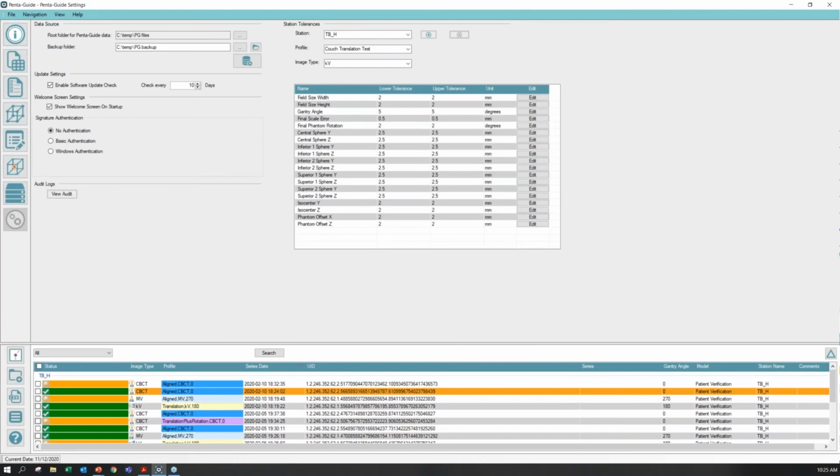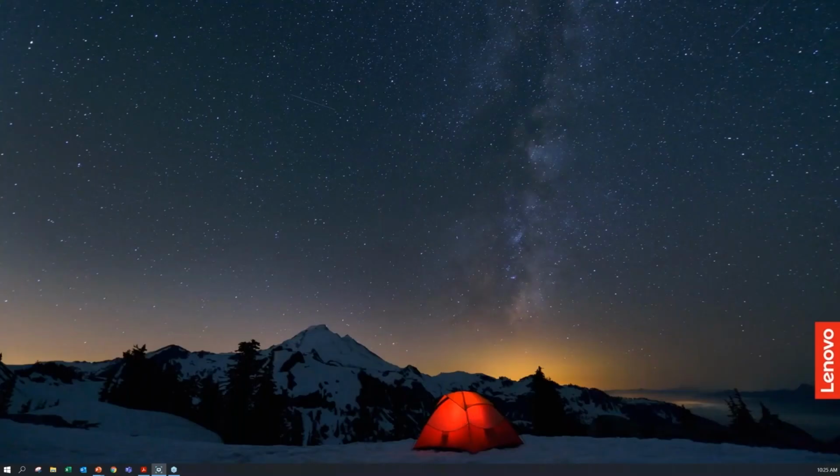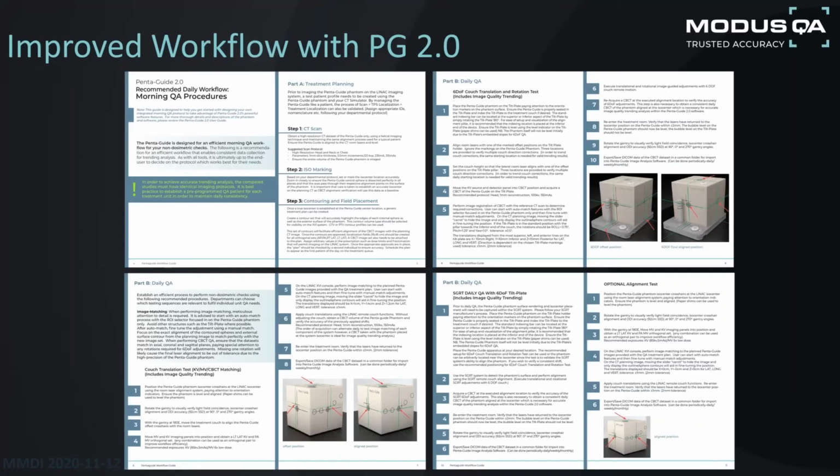Thanks for the demonstration. That seems like a really useful tool, giving physicists helpful information about their systems. And I guess the added checklist and isocenter entry pages should make record keeping easier for those wishing to use them. So is the software also free for existing users?